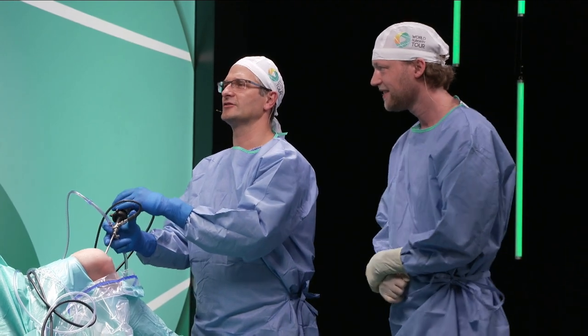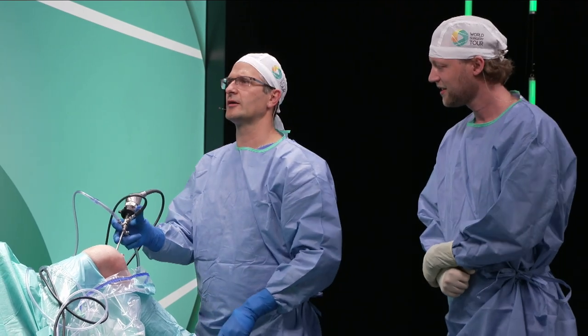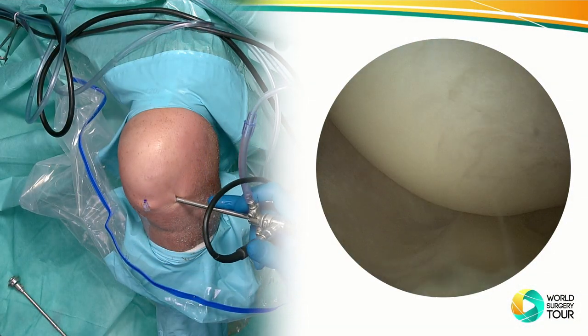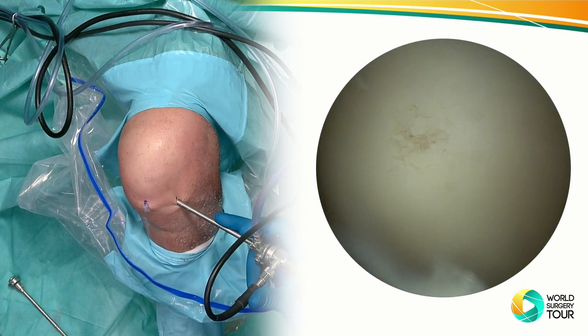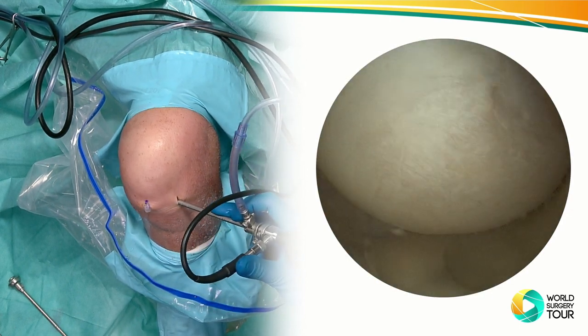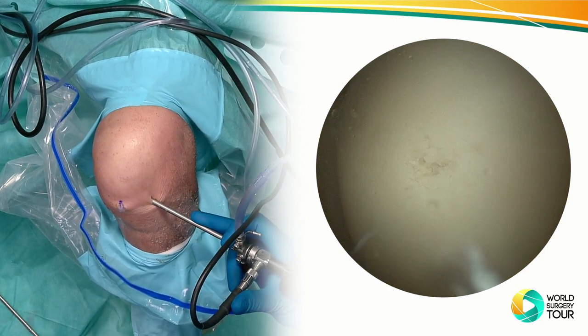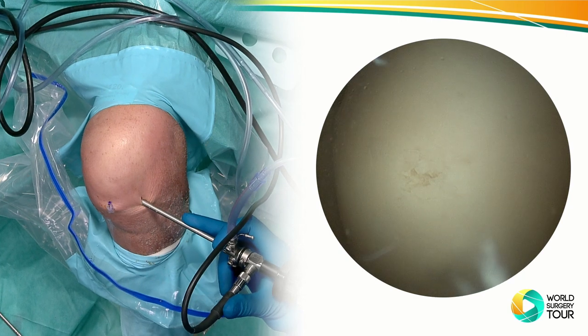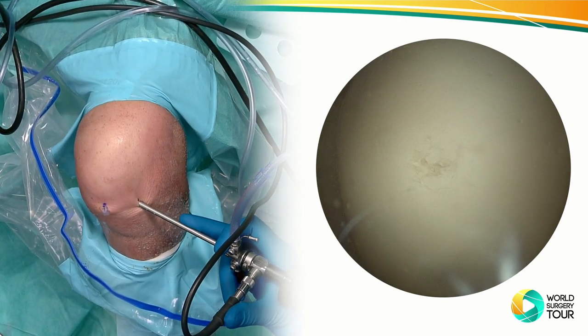So ideally, as you would always do it, you're going to start with an arthroscopic round and you will try to establish the site of the defect. Actually, Daniel was so kind to help me and prepare that a little bit. So let's get you a little overview. That's the medial femoral condyle. And as you can see, that we try to create this focal cartilage defect. Now that's pretty small. We try to enlarge it a little bit and then eventually going to see how to repair it.